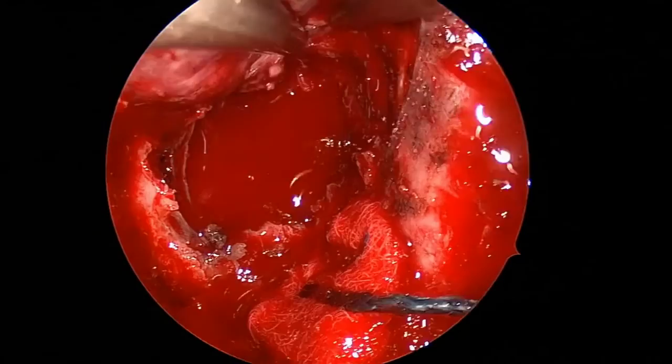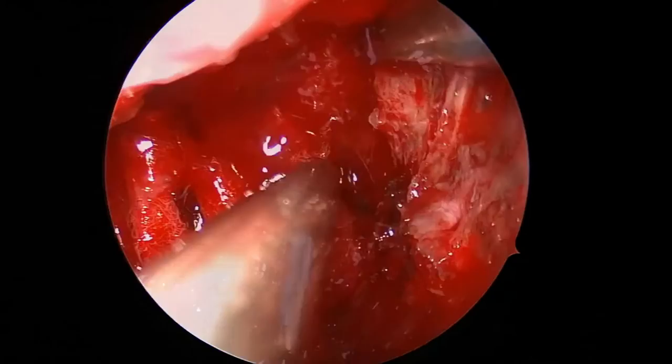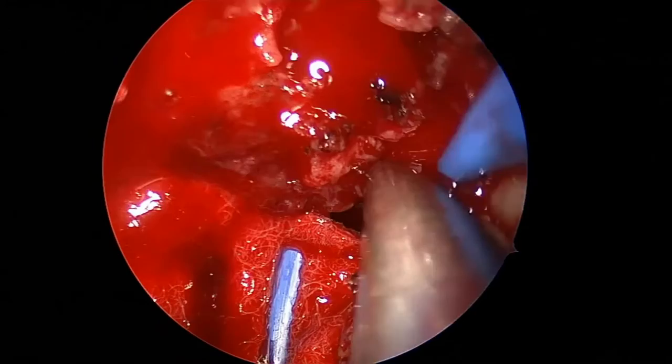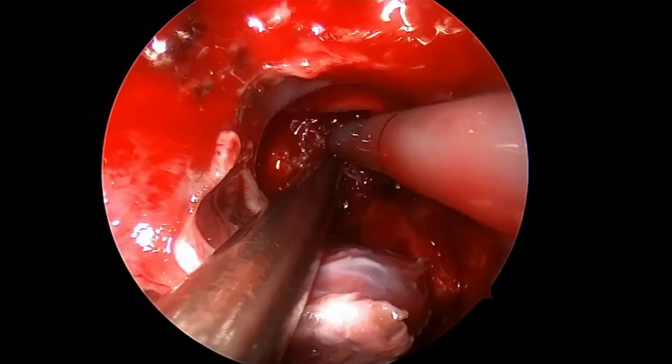Here we can see how we can work above and below the pituitary gland by means of this pituitary transposition. Here we see the sixth nerve in the bottom of the exposure. We keep dissecting tumor from the lateral aspect, where we find trigeminal nerve branches. And now we are cutting the tumor away from the oculomotor nerve that is displaced superiorly and medially, as the fiber tracking in pre-op shows.